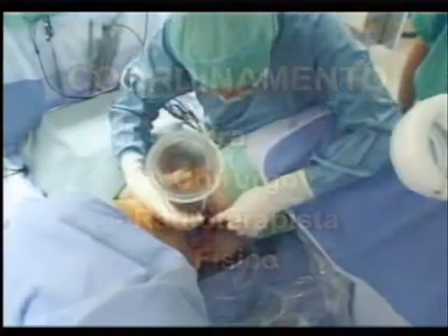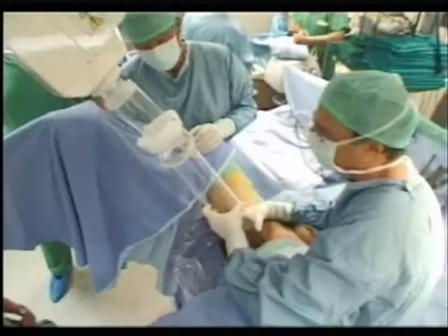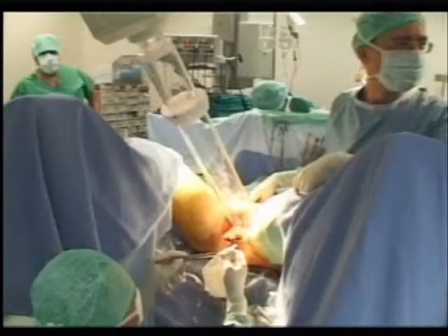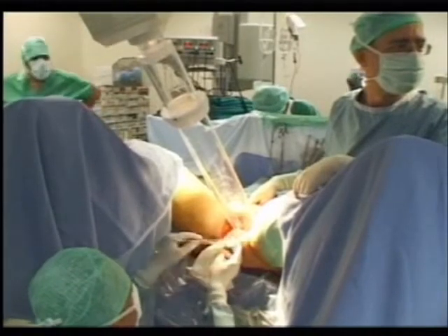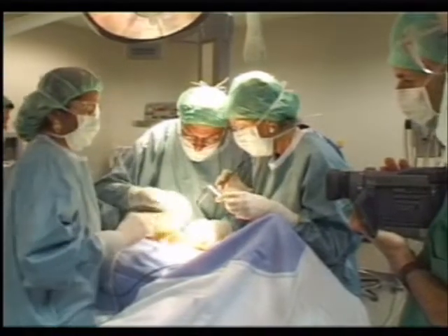ELIOT requires good coordination among the surgeon, the radiotherapist, and the physicist, who are supposed to agree on the optimal approach for identifying the area to irradiate and the best mobilization of the surrounding normal tissues. ELIOT may be used as the sole treatment or as a boost dose, as is more often the case, associated to conventional external beam radiotherapy, or as part and parcel of a multidisciplinary therapeutic approach.